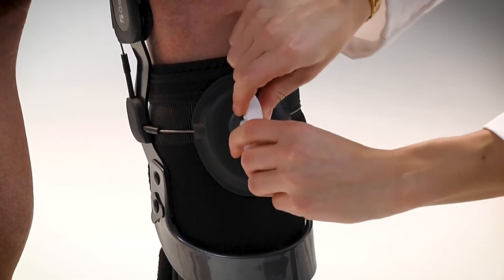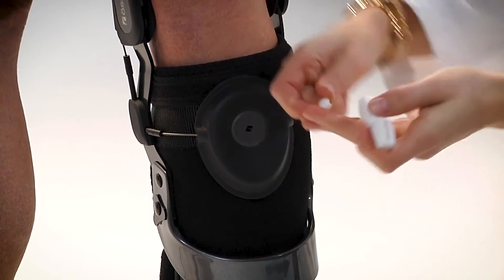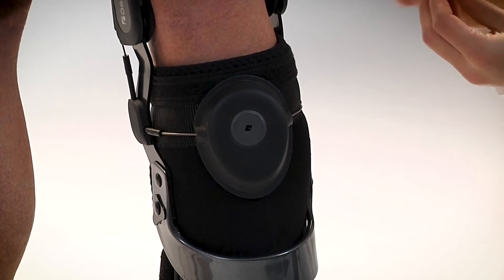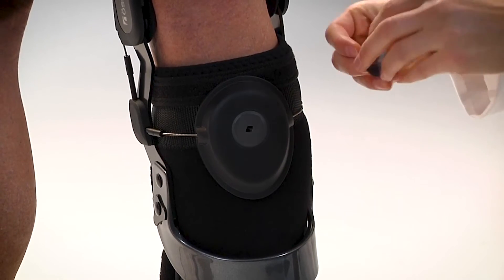Slowly turn the selected shear knob clockwise until it breaks, then discard the two pieces. Ensure that the DTS is centered between the shrouds with equal cable length on each side of the DTS. Place the supplied sticker over the DTS.